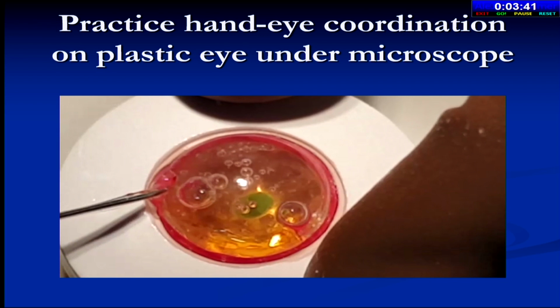Wet lab, how can I teach Phaco to someone in the cabin, though there is an instrument and 3 water bottles have gone down for one person, or 4 water bottles, because a beginner cannot virtually control things. And this artificial eye is not a capsular bag, so the fluid tends to flow anywhere. But it gives a very good feeling of the nucleus, so you can do the trenching and learn both foot use. Phaco learning with the artificial eye is very, very good.